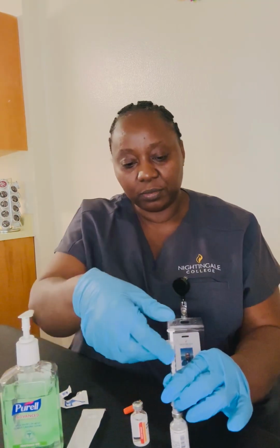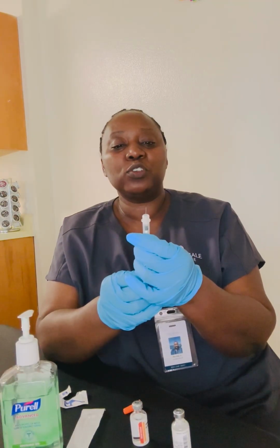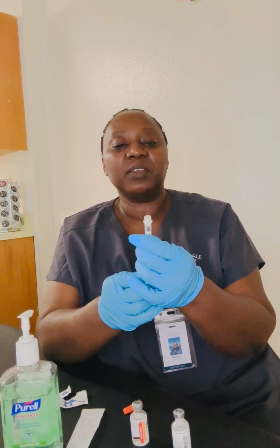8 units of air, and then I'm going to push that air into the NPH without touching the medication. Once that is done, I'm going to now pull back 4 units of air into the regular.